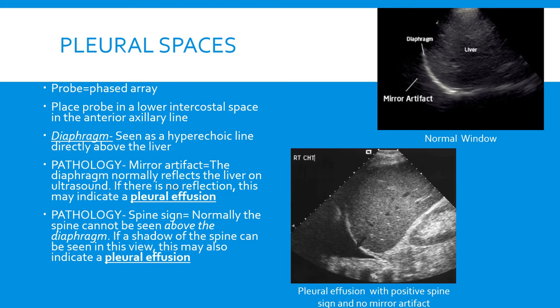The first thing I want to point out in that picture is the diaphragm, which is a hyperechoic line directly above the liver. Remember, above the liver is to the left of the screen because we have the indicator pointing towards the patient's head. On either side of the diaphragm we see what looks like liver — this is a normal finding caused by the diaphragm being very reflective, bouncing the sound wave back and making it appear as if there's liver on both sides of it.